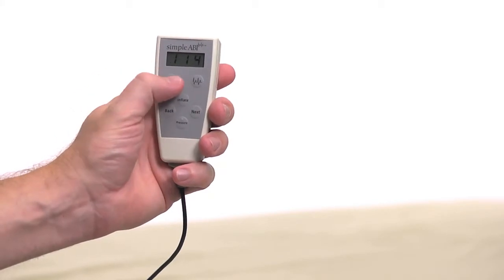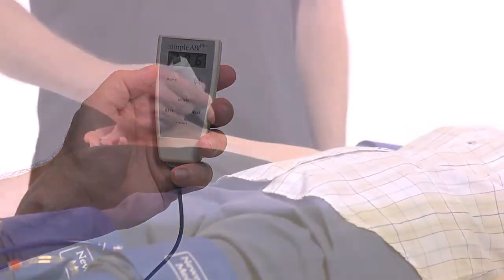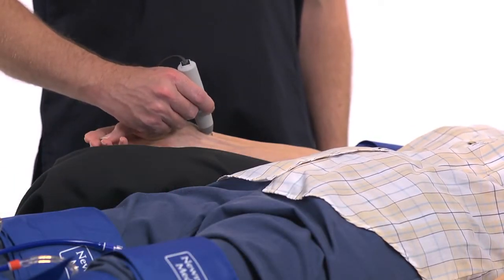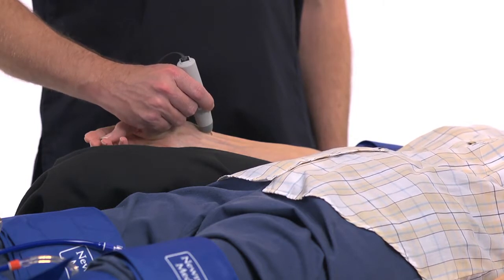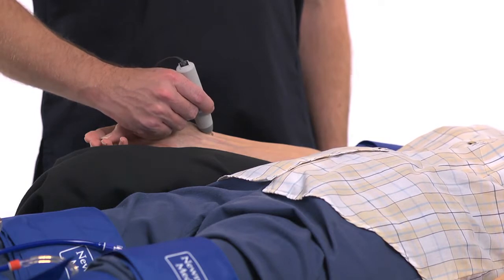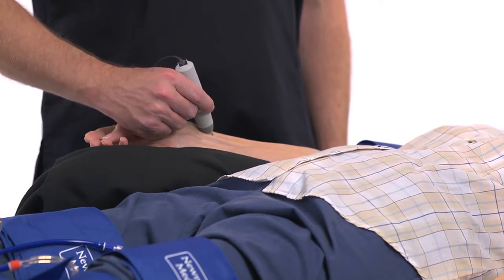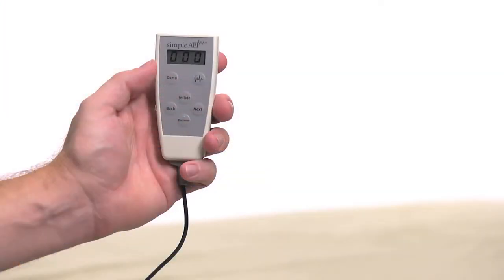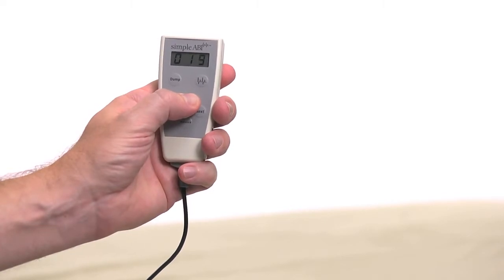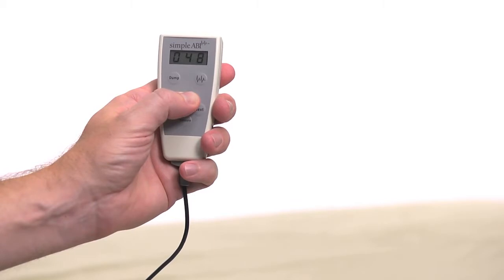Finally, Dump is a safety button that overrides other operations. Use the computer cursor and click on the right brachial field. Place the Doppler probe at a 45-degree angle to the skin over the radial artery. Move the probe slowly back and forth until the strongest arterial signal is heard. While listening to the arterial blood flow, press and hold Inflate on the CuffLink remote and inflate the cuff until you no longer hear the signal, and continue for an additional 20 mm.